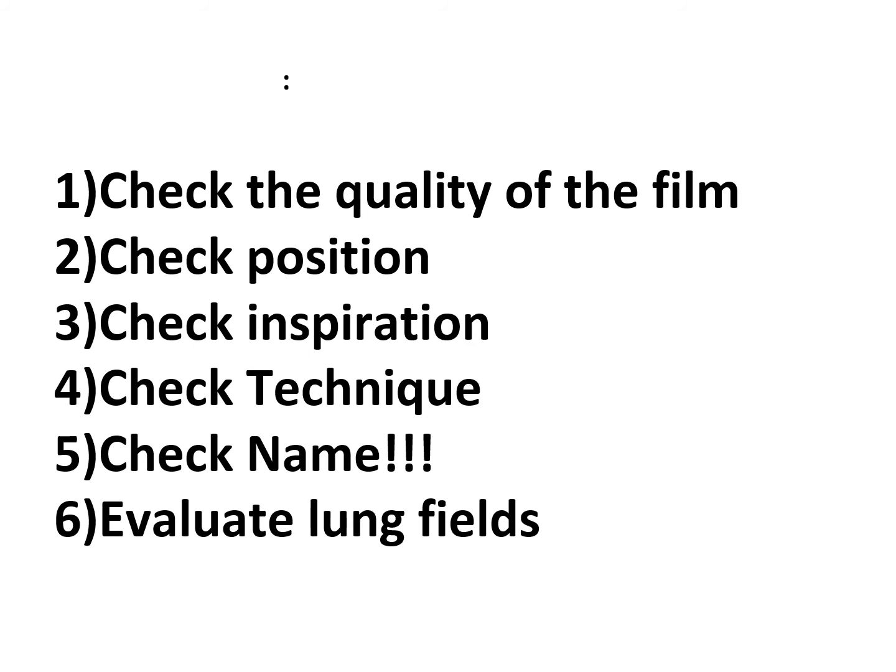It's radiology, of course, that's their job too. They want to make sure the quality of the film is good. It's just part of a systematic process, checking to make sure it isn't overdeveloped or underdeveloped. That's obviously not our job, but it might be something that we might note.